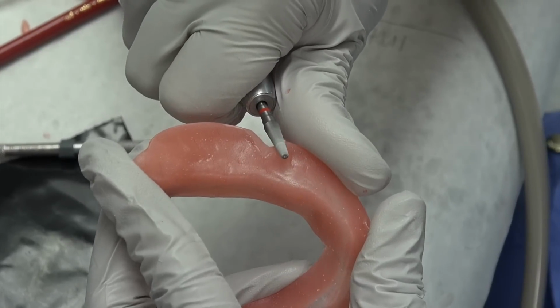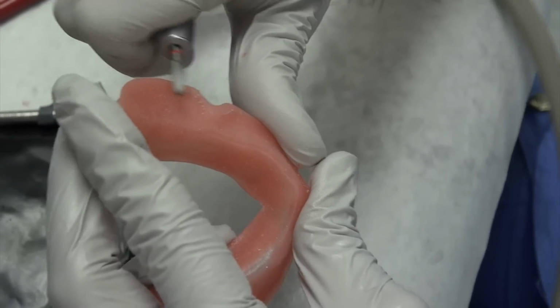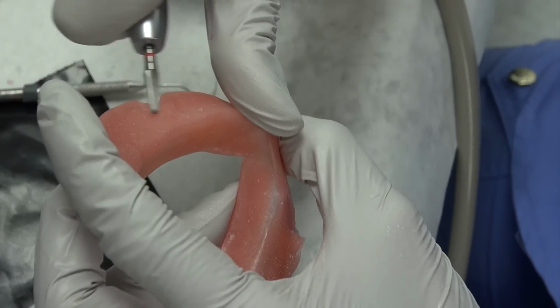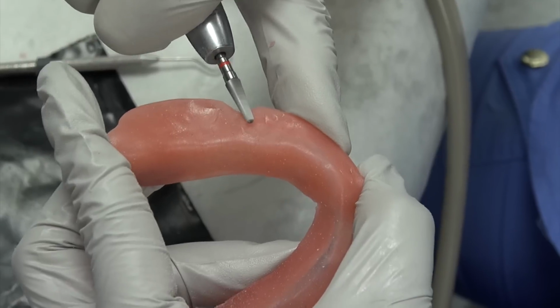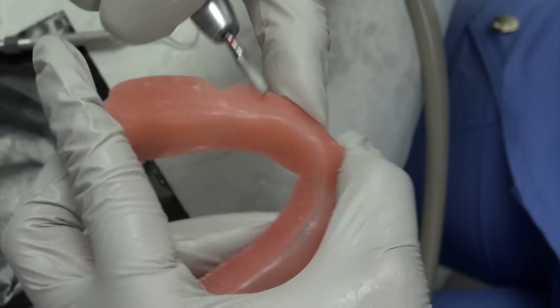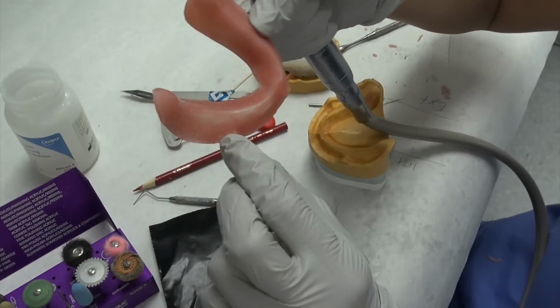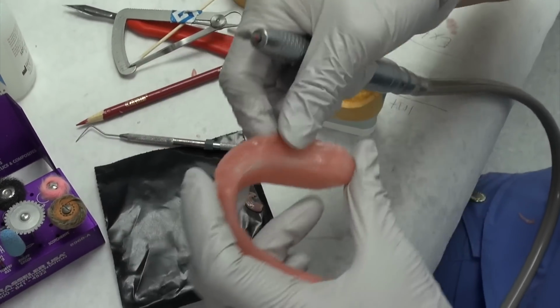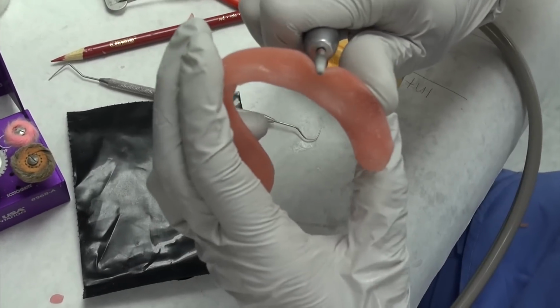Now, what is this going to do? This is going to allow for... the material kind of clumps up a bit right here. Okay, so you want to thin that out so it's not excessively thick. Like if you look right here, this is literally thicker than any of the other parts. Okay. So again, just roll it up.